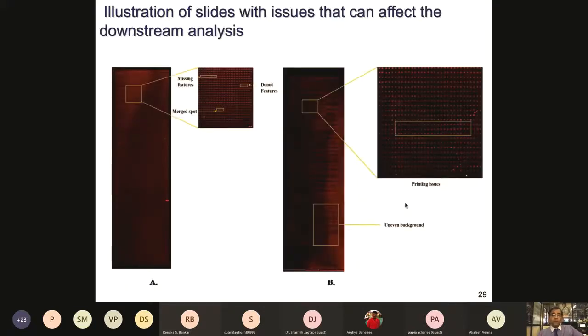And when you do the immune response screening, again, sometimes you find, in this case, probably the patient serum was too concentrated. Dilution was not appropriate, too much background, we can see it here. So these regions may not be good to take forward. So you need to optimize this slide. Either this could be an array problem or this could be a serum concentration problem. You have to actually avoid these background issues, right?